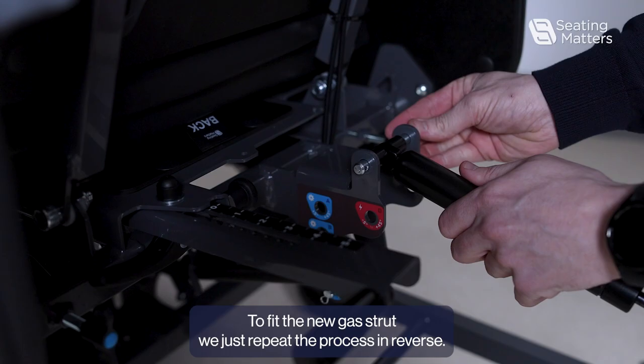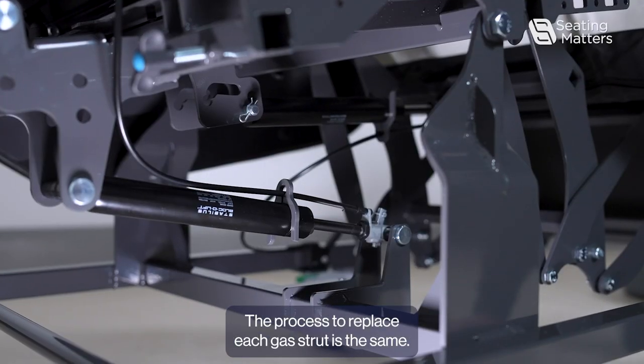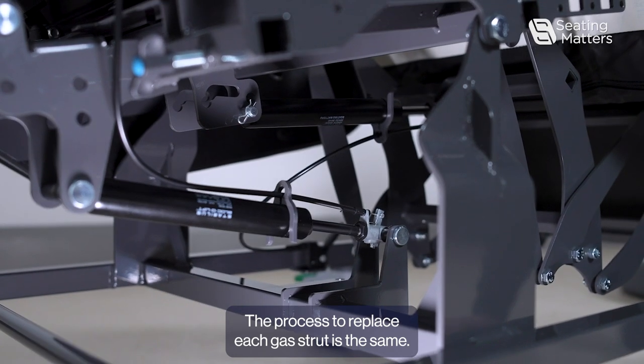To fit the new gas strut we just repeat the process in reverse. The process to replace each gas strut is the same.